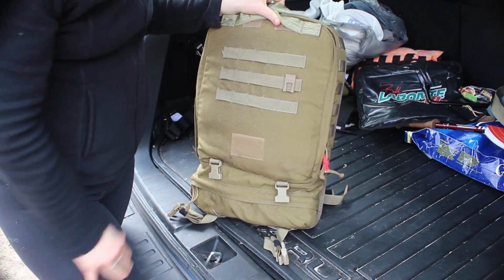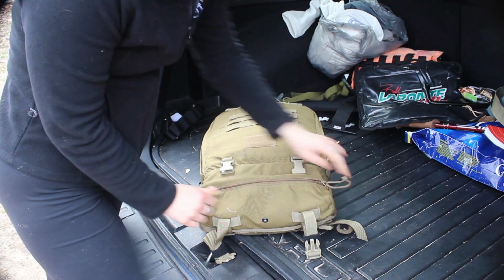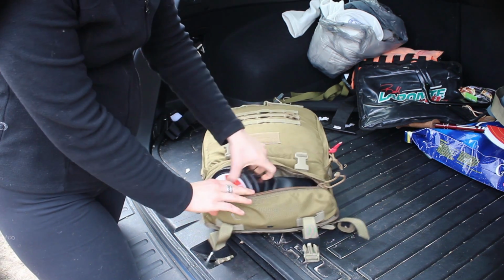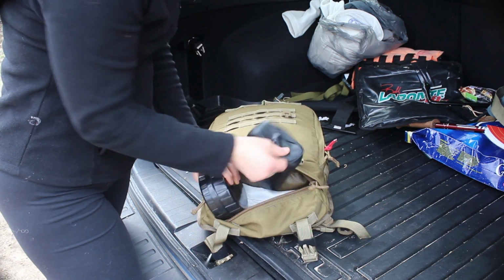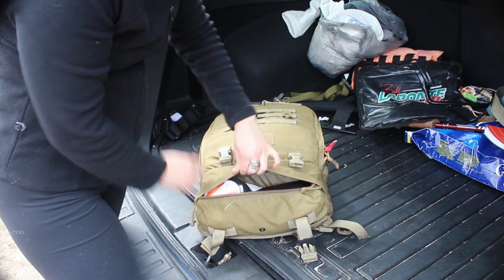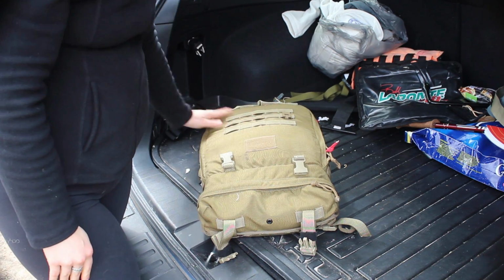This was actually given to me by a friend who's an 18 Delta, and the neat thing about the bottom compartment here, it zips open and you can put other essentials in there that you like. What I have is a collapsible ambu bag, so this is the thing that you put over people to help them breathe, and then also have a blood pressure cuff in here. But you can put whatever is in your mind the most necessary down in your kit to tailor it to your own personal needs.